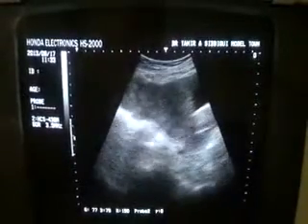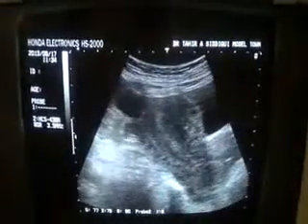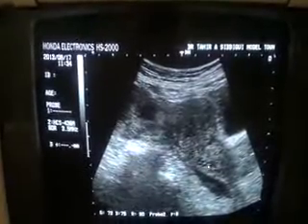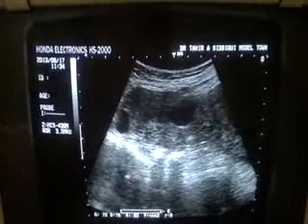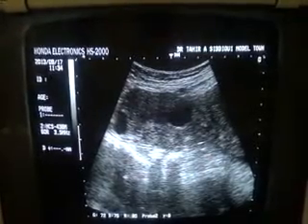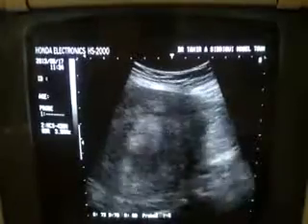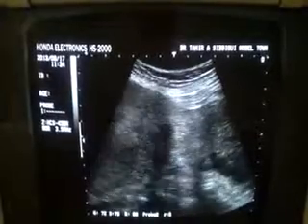So this is a case, to me, of ruptured ectopic pregnancy because of the fluid. This is the fluid posterior to the uterus, and 2 gestational sacs in the region of the right adnexa, if the pregnancy test is positive, and there appears to be no other reason other than this fibroid in the uterine fundal region.